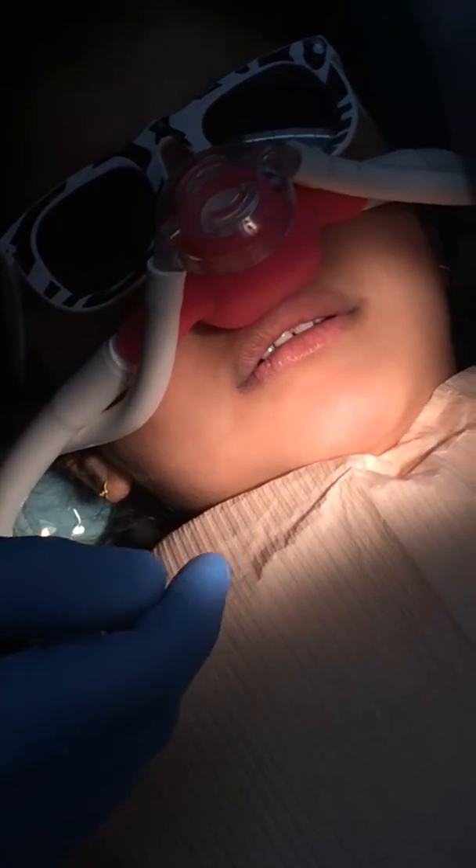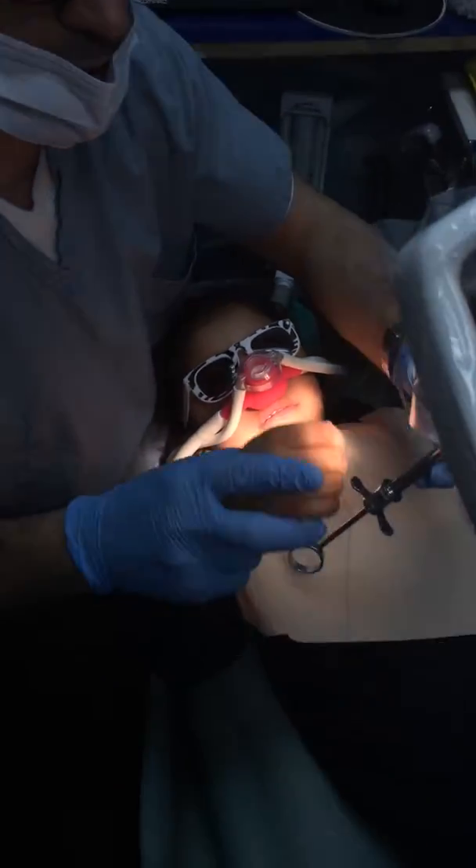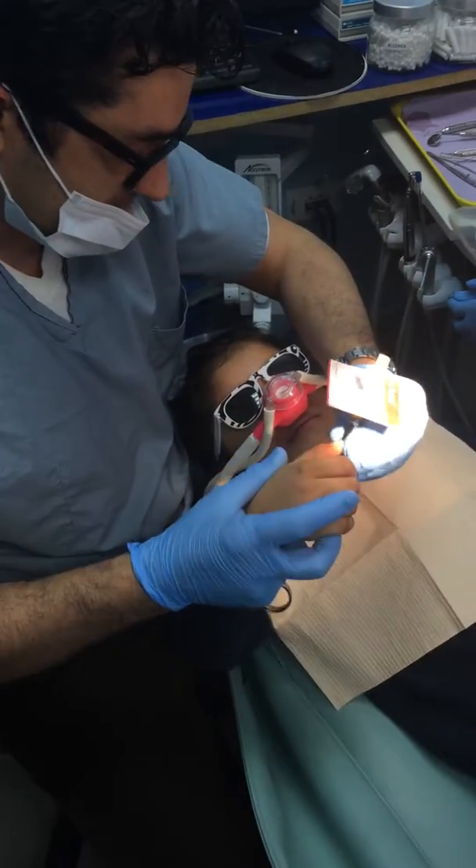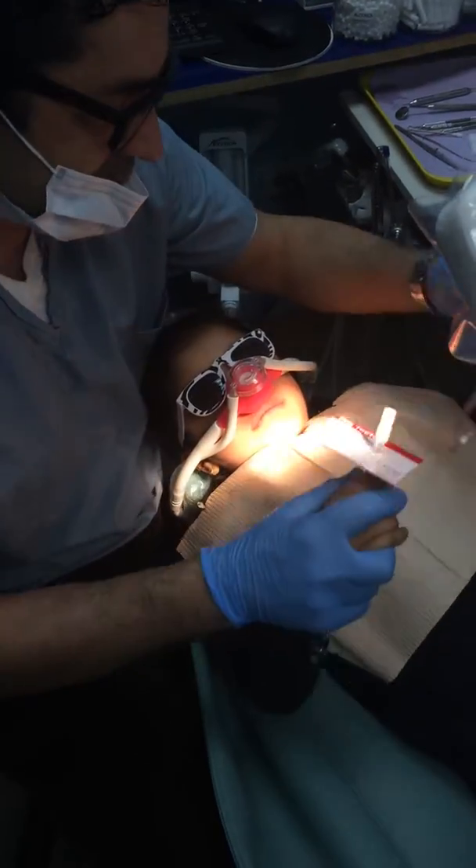Now we're going to use our little Hello Smile technique for local anesthesia. Sometimes we show the syringe to the child, sometimes we don't. We're just going to go ahead and use the sleepy juice to put your teeth to sleep, just like this.